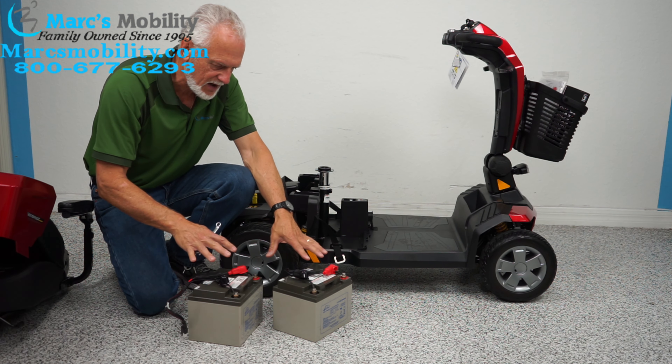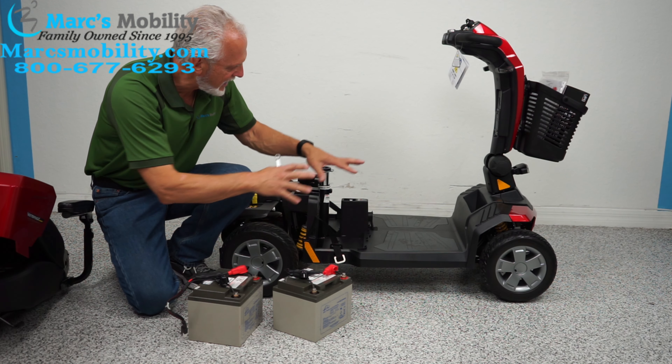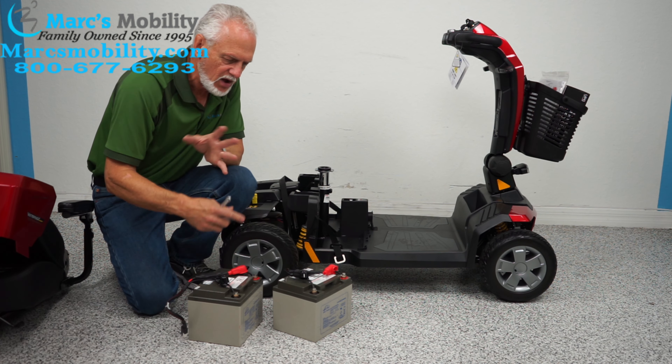Sometimes you might find smaller batteries in there — it doesn't really matter if you have smaller batteries, but if you're changing your battery you just won't get as far.